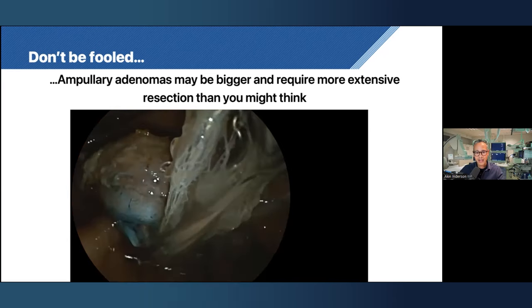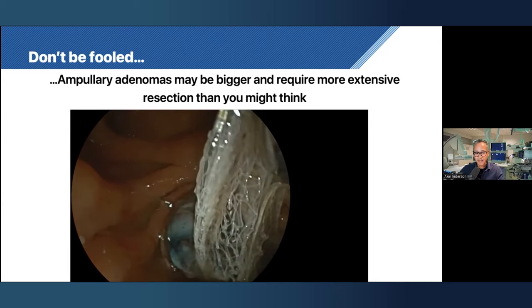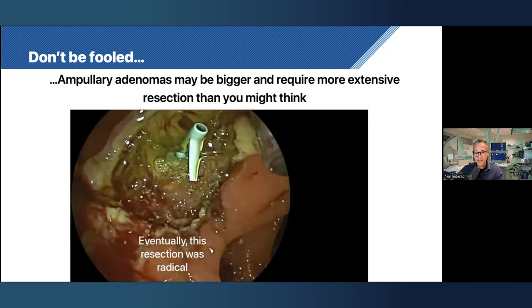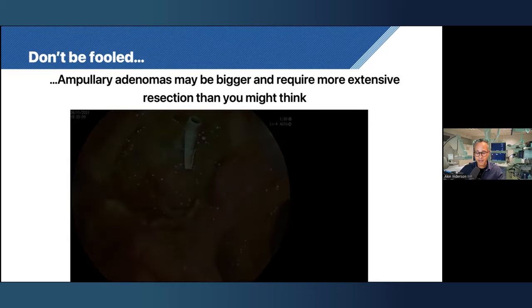You see that there is a very large wound bed now. And again, do pancreatic stenting, and this was radical eventually, but you have a very large wound bed and a very high chance of rebleeds.